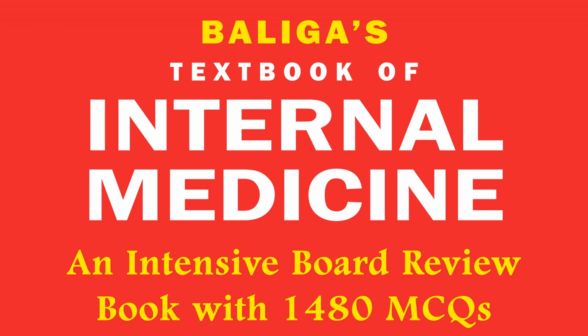Cardiac magnetic resonance imaging, CMR, with use of tissue characterization techniques such as late gadolinium enhancement, LGE, and the presence of myocardial edema is the gold standard non-invasive imaging test for diagnosis and risk prediction in myocarditis of other etiologies. Endomyocardial biopsy is a diagnostic gold standard for myocarditis. However, it is underutilized due to its invasive nature and complication rate, which spans from 0.3 to 6%.